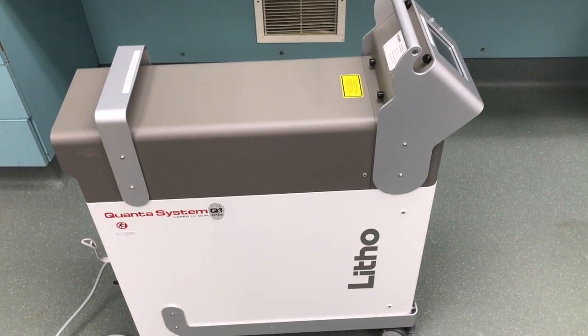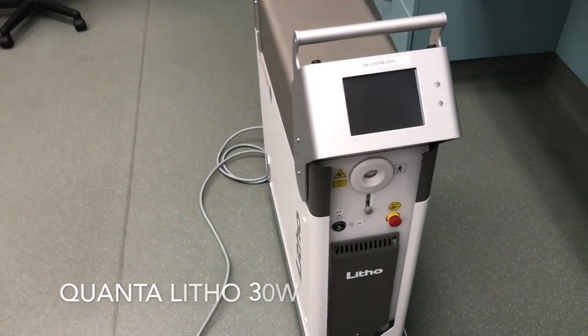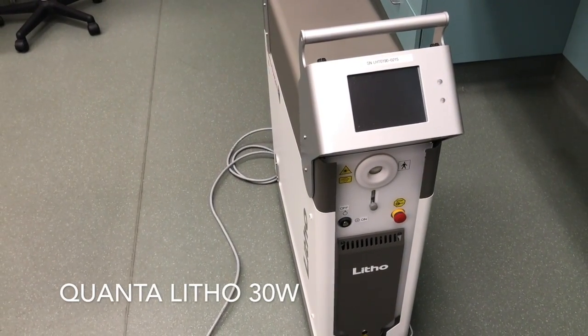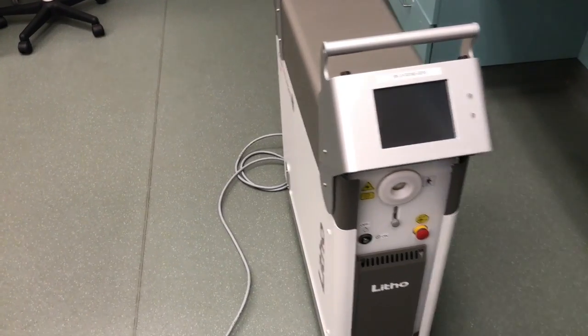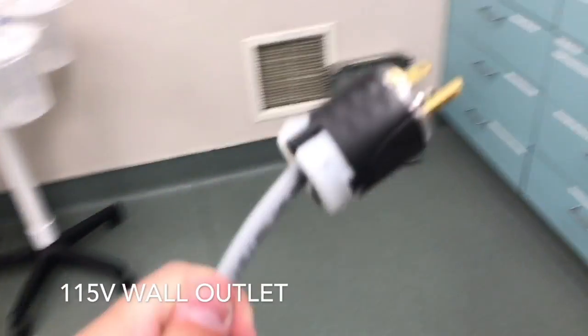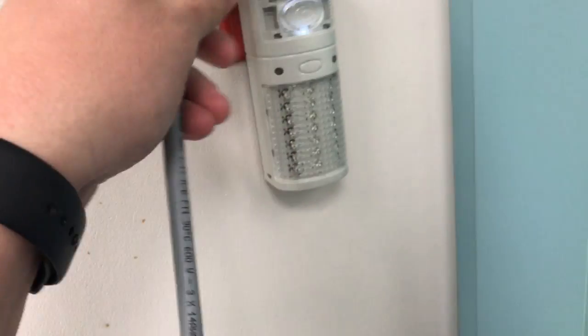This is the Quanta Litho 30-watt Holmium laser system. This demo video will show you a quick run-through of all the aspects of this laser and how to run it. First, plugging it in — you're going to plug it into a wall outlet. No power strips. This can plug into any standard outlet.